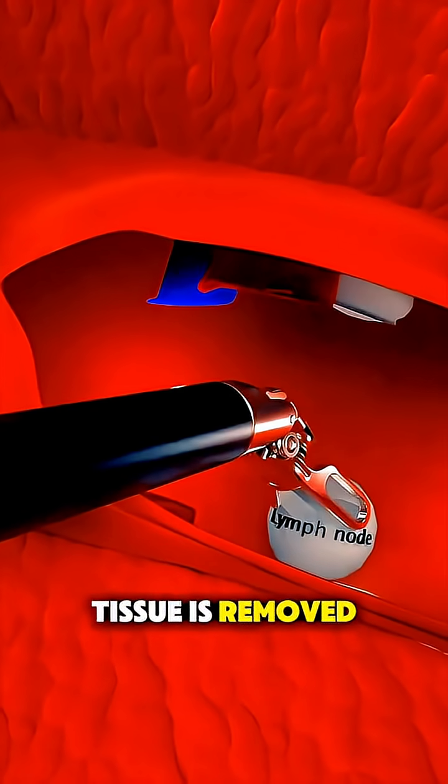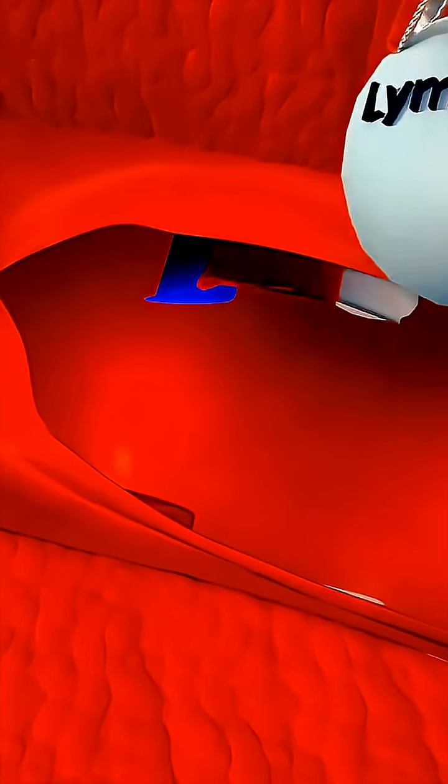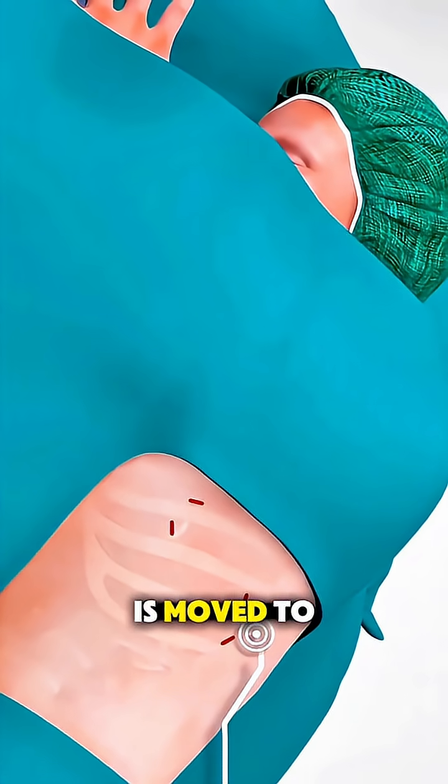Once the diseased tissue is removed, the instruments are withdrawn, the small incisions are closed, and the patient is moved to recovery.